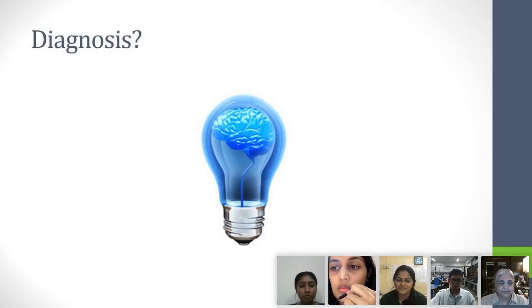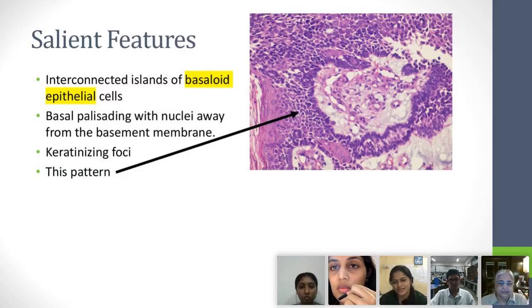It will be ameloblastoma because we saw the ameloblastic epithelium. Yes, very good. Ma'am, but the cells in the last slide which we saw had prominent eosinophilic nucleoli. So can we think of melanoma? Can we think melanoma? All right. So, anybody to say anything to Kshitija? We've just got the salient features over here.